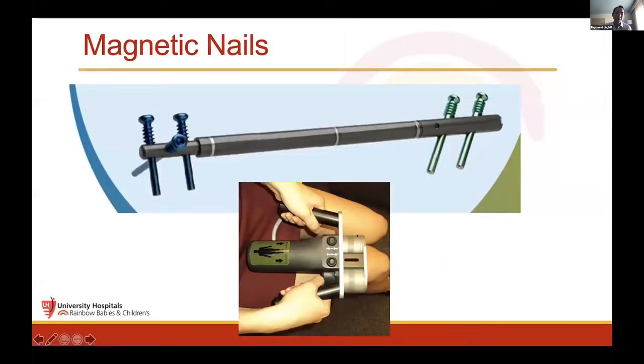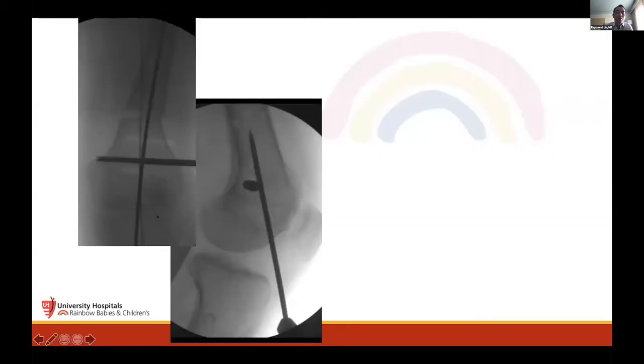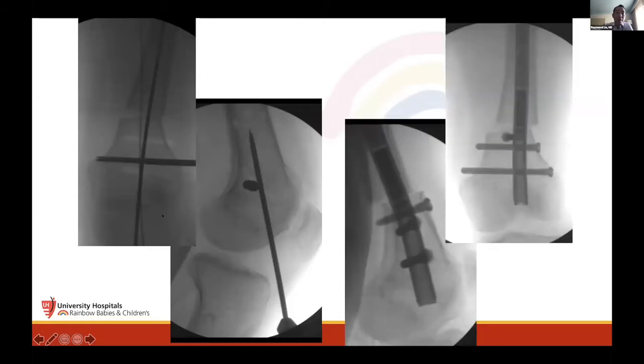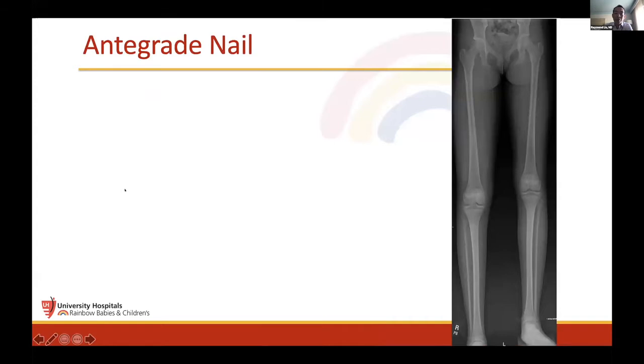But things have kind of changed recently. These magnetic nails have finally given us an internal option that's very reliable. And so nowadays, if a 12-year-old comes in and has this significant varus deformity and also has a substantial shortening because of their Schmid metaphyseal dysplasia, then I might just give them a little bit of length while putting in one of these nails to correct the varus. And in doing so, can get them to the point where they get a little bit extra length. They are partial weight bearing for a while, so that is a disadvantage, but I can get them to full weight bearing by about 3 months in this kid with a pretty good result.